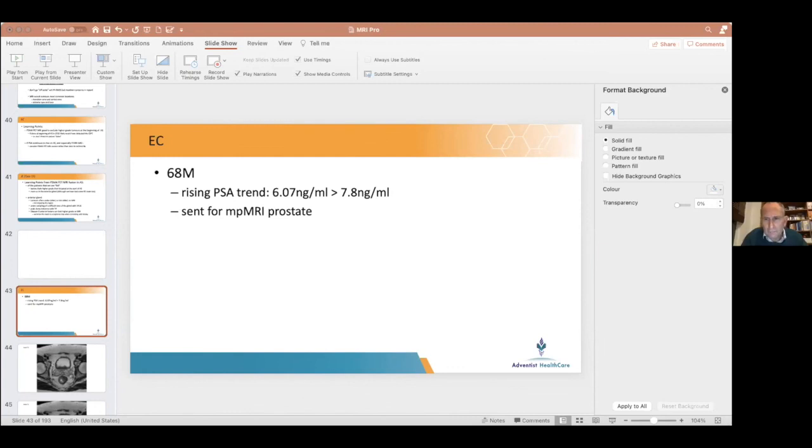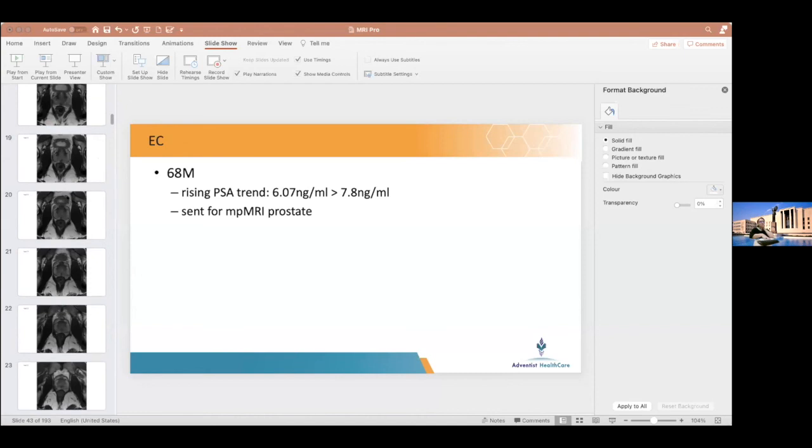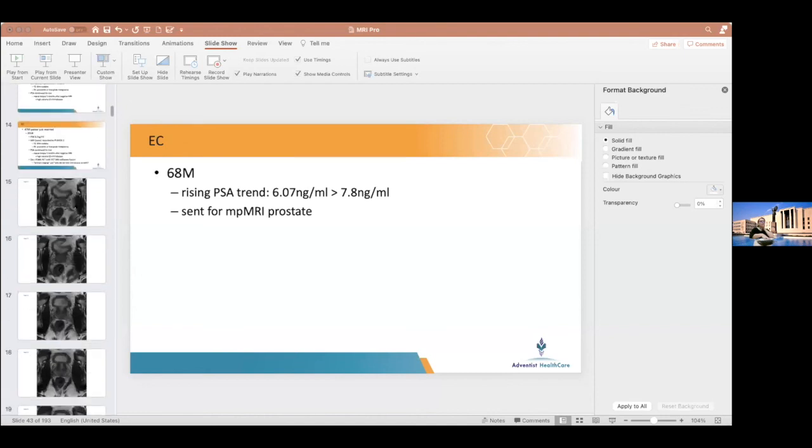Valeria. May I ask Lisa a question, please? Lisa, sorry, thank you for the case. So my question is, what about the peripheral zone histopathology, histology? Was peripheral zone negative? Because if you look at the MRI, at 5 o'clock, you can see a focal restriction.